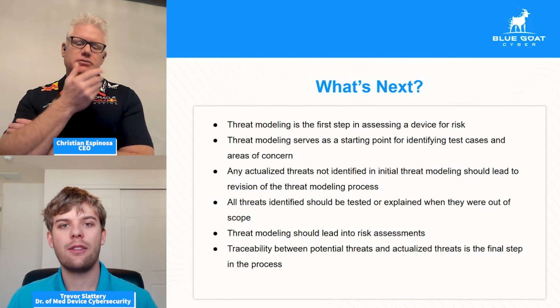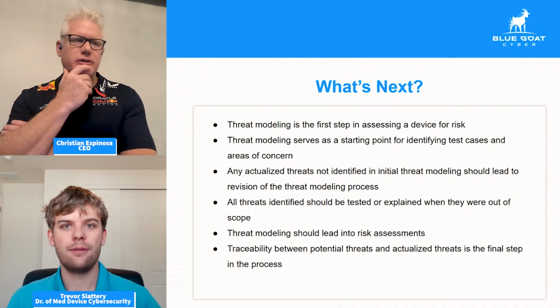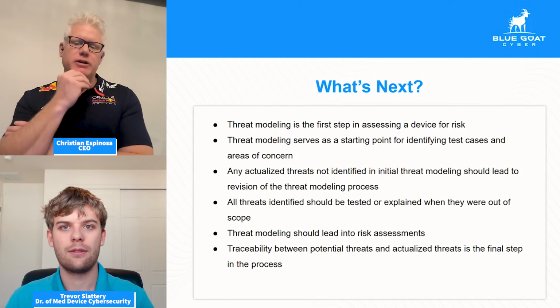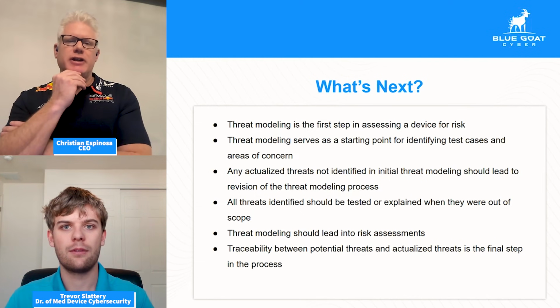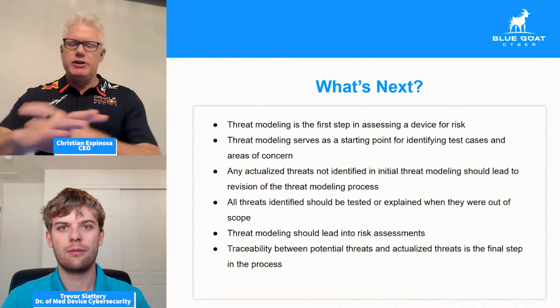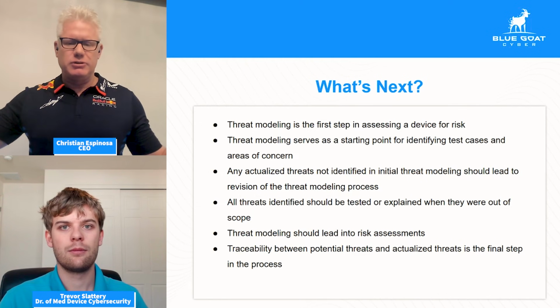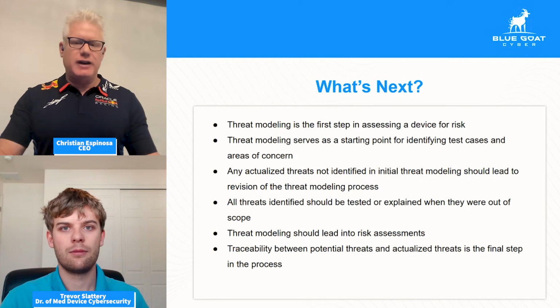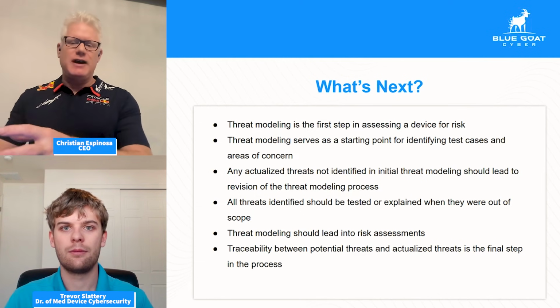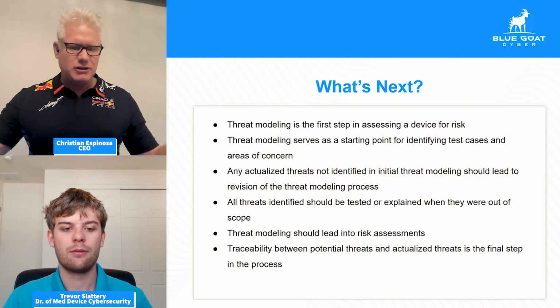Yeah, and that's a good point. I just had a conversation with a prospect a couple of days ago, and they were frustrated with a cybersecurity company they hired because that company was recommending all these generic cybersecurity controls for a critical device that a surgeon needs access to. They were telling them they needed multi-factor authentication and, like you said, these long passwords.